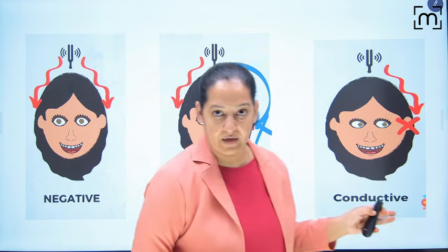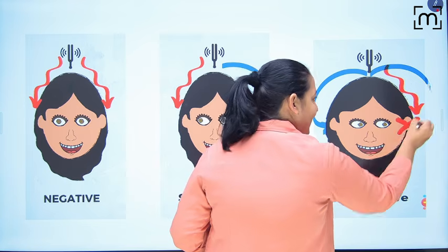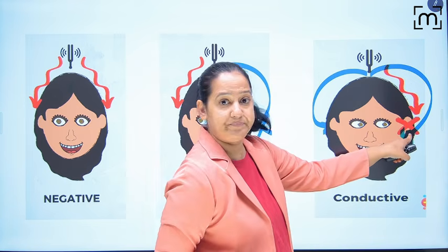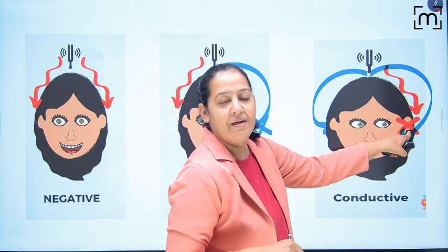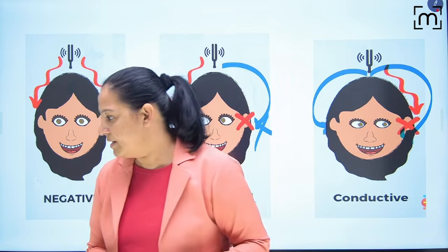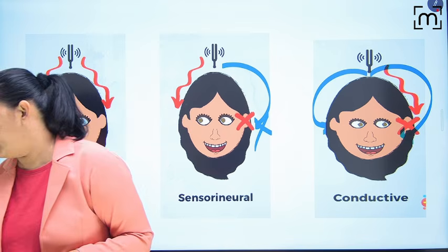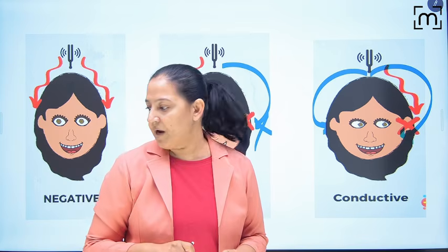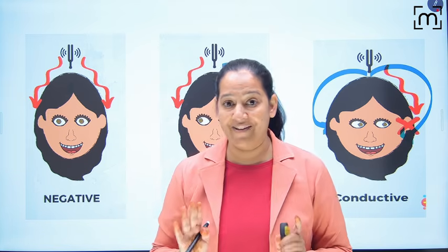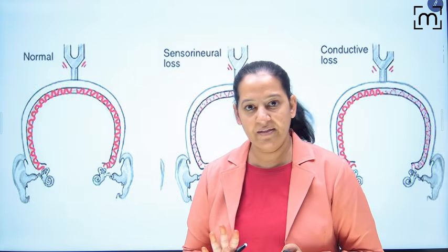But in case of conductive deafness, both the mastoids are activated. But since here there is no background noise, it is appreciated better in the worse ear. Lateralization towards the worse ear. Okay, everyone understood? I'm coming to the bilateral cases. Don't think about the bilateral. First you understand unilateral. I will come to the bilateral. Unilateral, there is no problem.